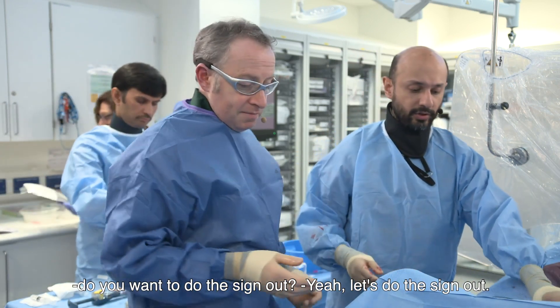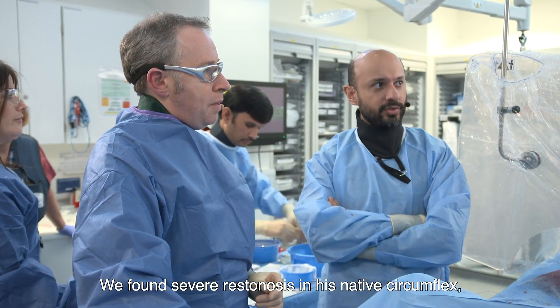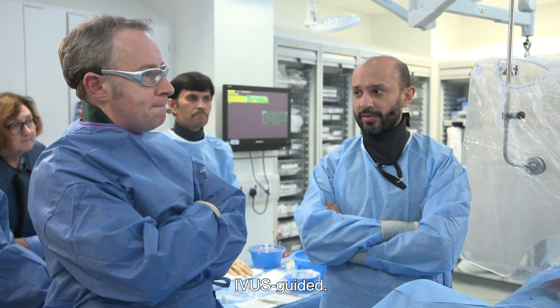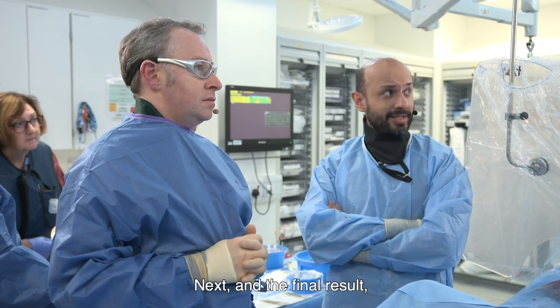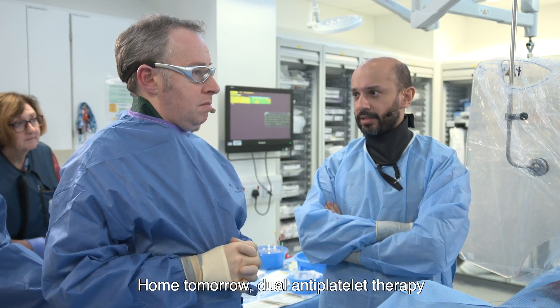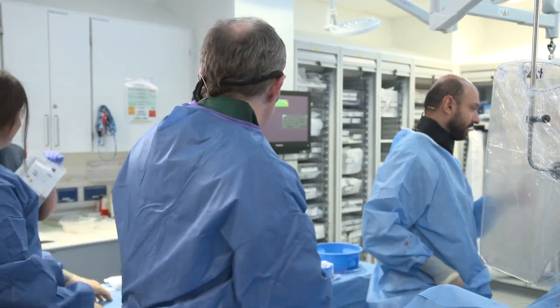Let's do a sign-out. It's going into his left posterior lateral branch. We've treated that with balloon angioplasty and drug-coated balloons, IVUS-guided. We've lost one of the OM side branches which we've rescued with kissing balloon inflations. An excellent final result with TIMI 3 flow into all the branches. He's going to have an angioseal to his right femoral puncture, home tomorrow. Do you want to take the therapy long-term for him? I think so. Great, well done. Nice case. That's us done for the day.